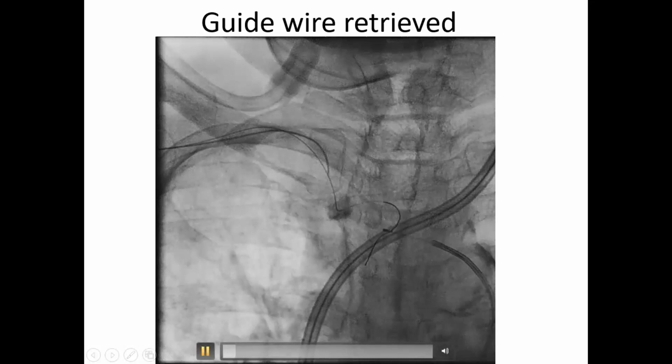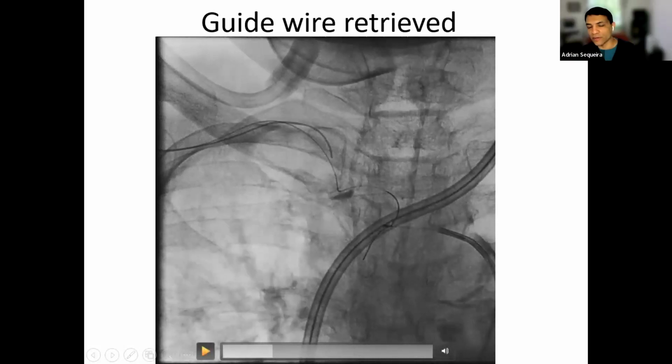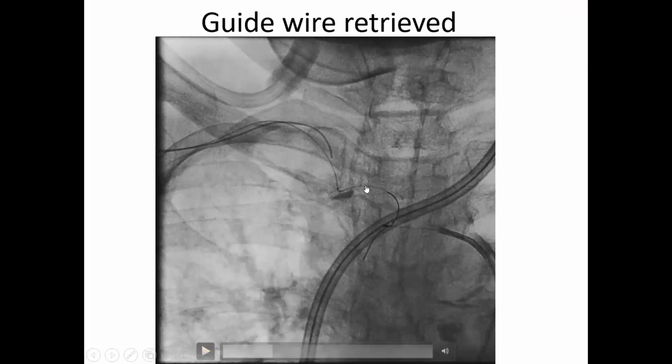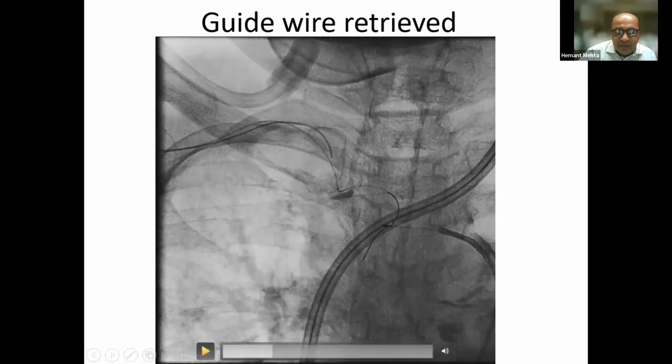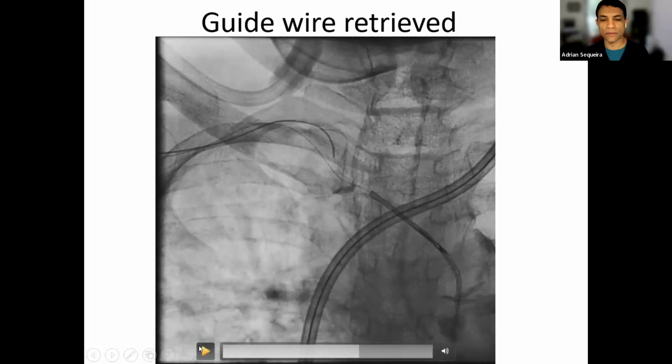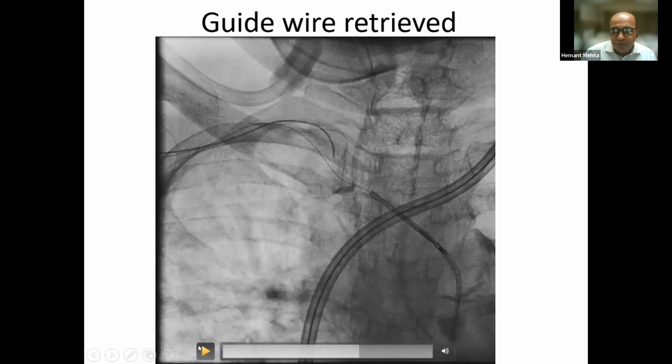Got it. So you made a snare out of the wire. That's what I was going to ask too. Yeah. Because we had pushed it, we had already created a loop here. Purposely, this loop was created. And with this, now see how it is catching. Once we were on the wire, we could just pull out everything.